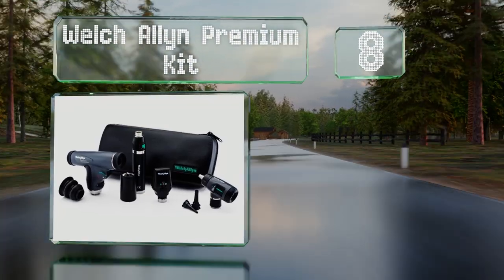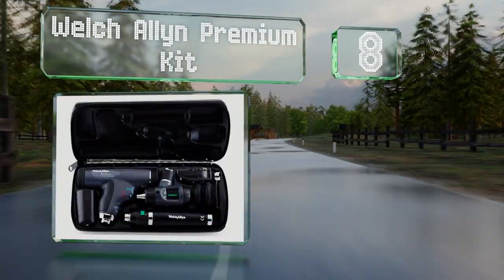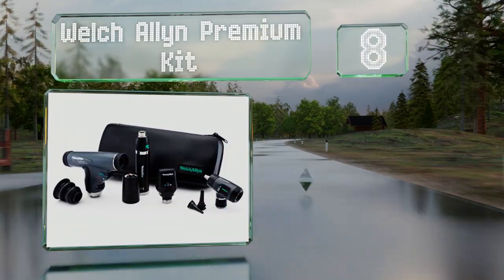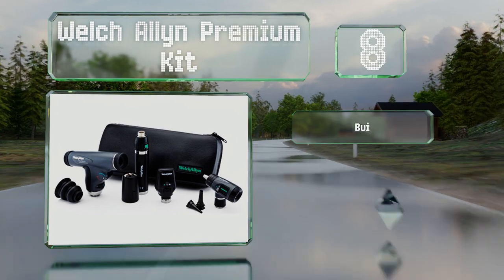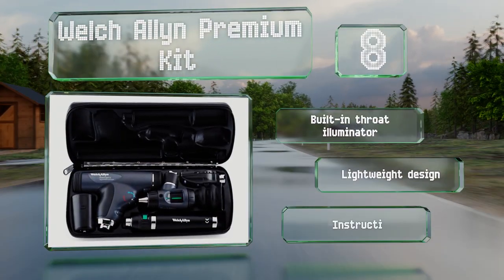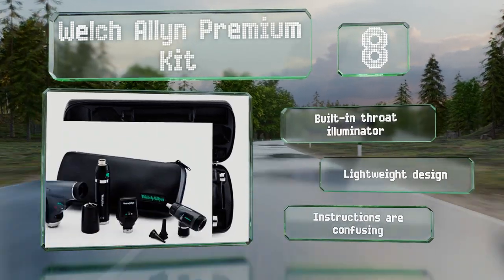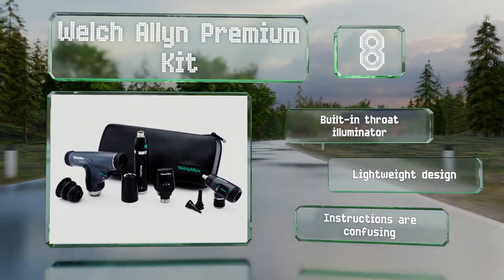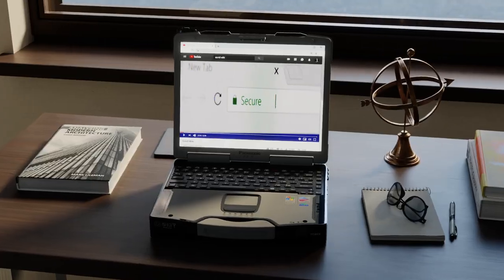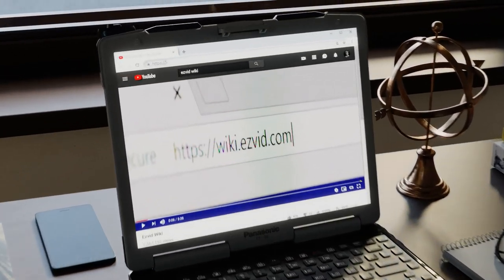Coming in at number eight on our list, the Welch Allen premium kit consists of both an otoscope and an ophthalmoscope. The former has a rechargeable lithium-ion battery in its handle that provides illumination for up to two hours. It is very expensive, though it includes a built-in throat illuminator and is a lightweight design. However, the instructions are confusing.